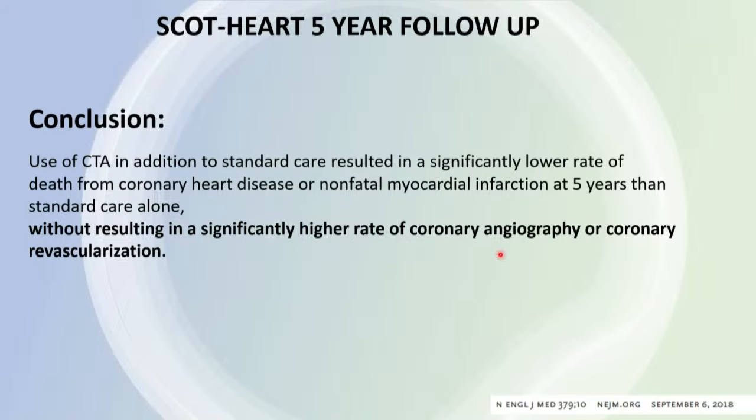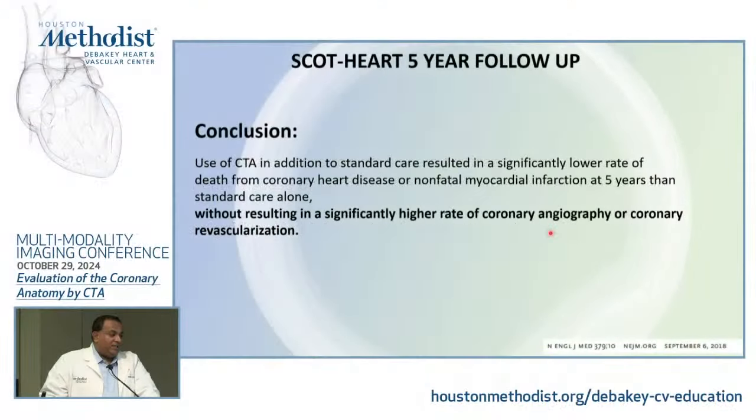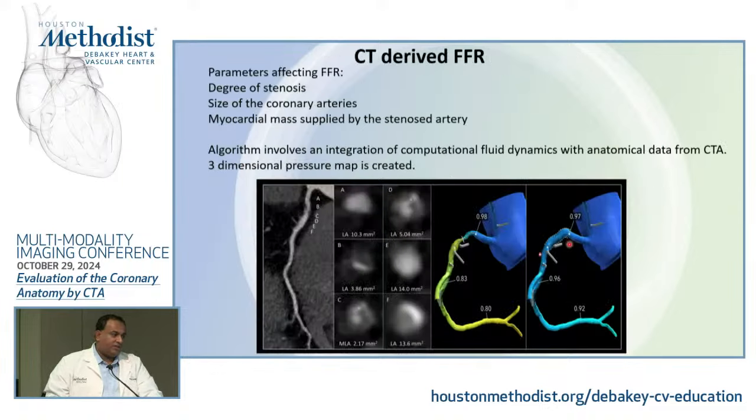So the conclusion is very strong from this follow-up data that use of CT in addition to standard of care results in a significantly lower rate of death from CAD or non-fatal MI at 5 years, without resulting in a significantly higher rate of coronary angiography or coronary revascularization. All right, so those were the three landmark trials I wanted to talk about.